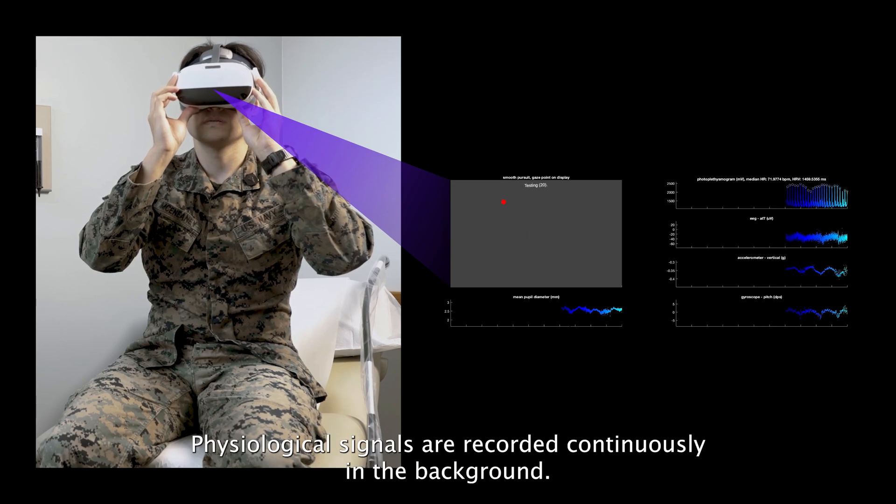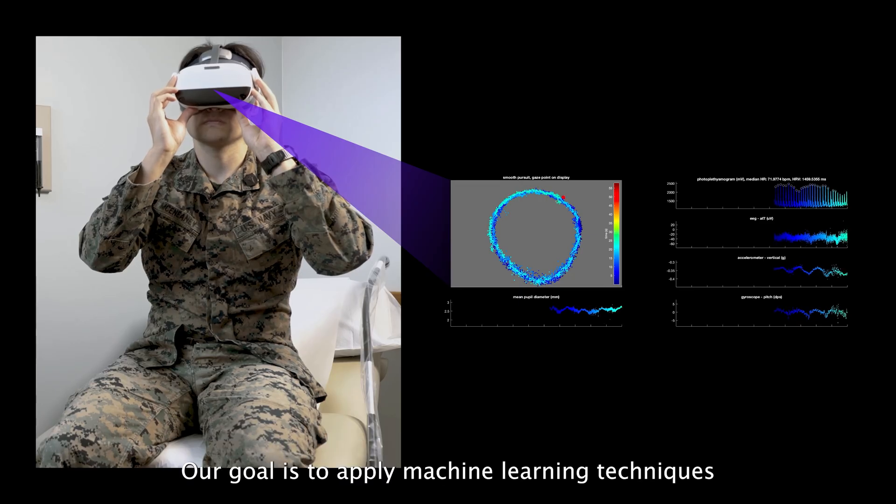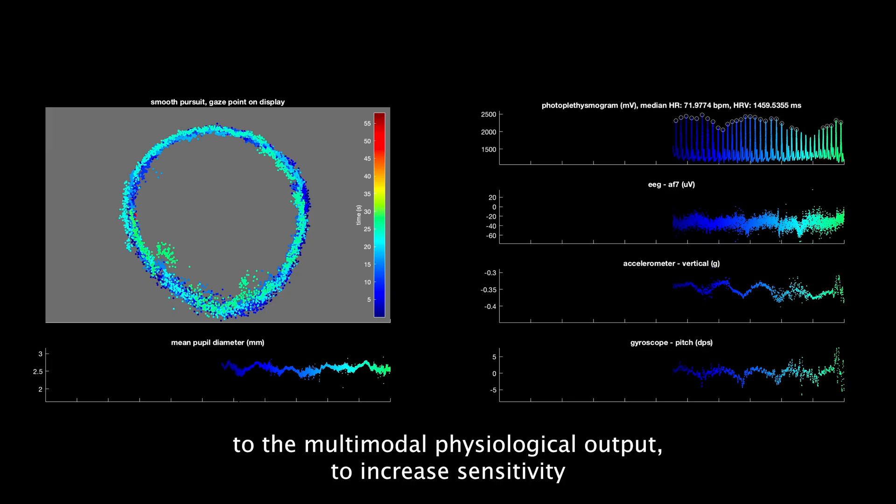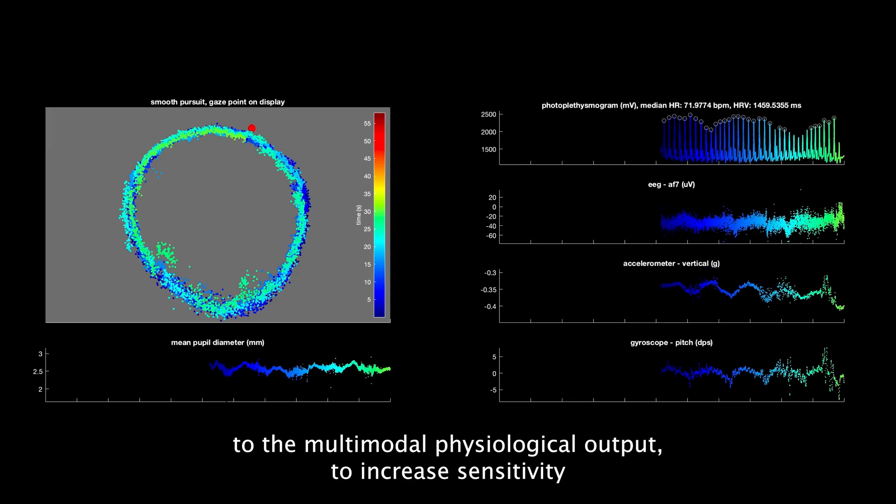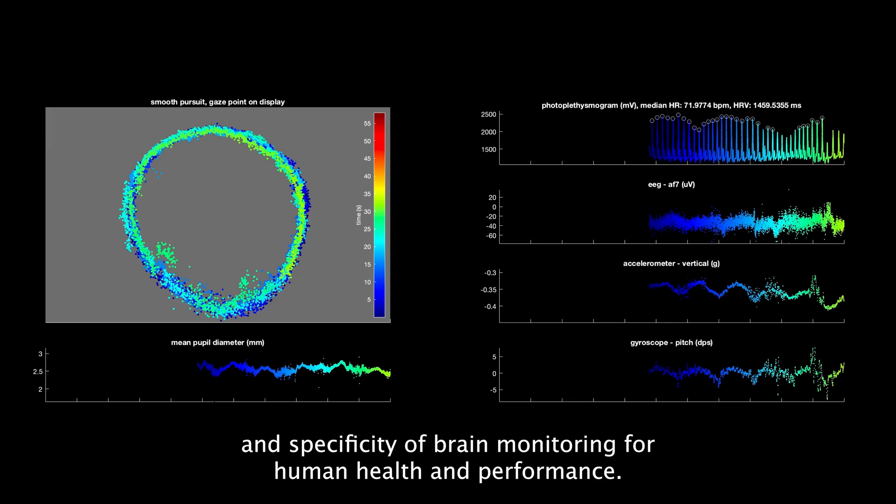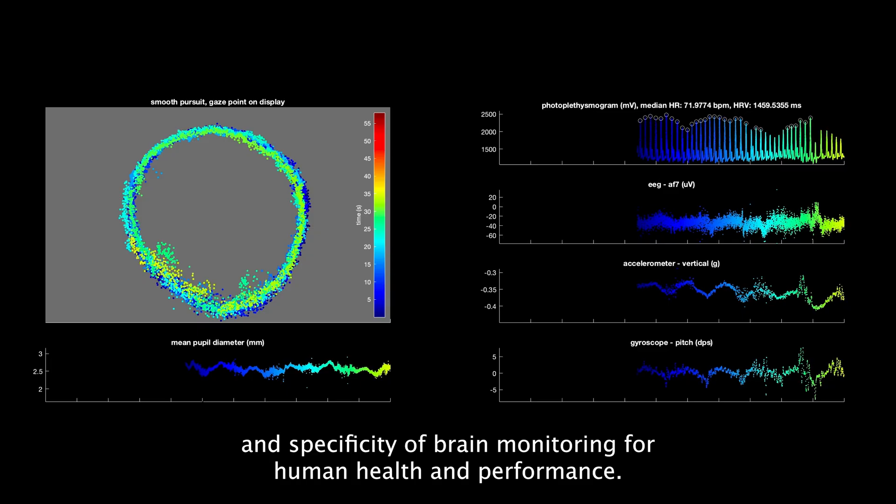Physiological signals are recorded continuously in the background. Our goal is to apply machine learning techniques to the multimodal physiological output to increase sensitivity and specificity of brain monitoring for human health and performance.